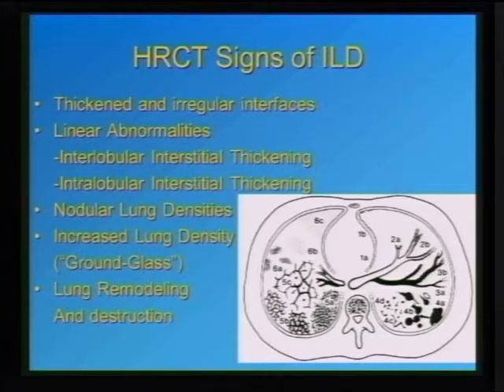This is a diagram that I'm getting from a work that was done over 30 years ago when we started playing with interstitial lung disease. And if you look at the different signs in this diagram, I have all the signs that are depicted on how to recognize interstitial lung disease, especially early interstitial lung disease.